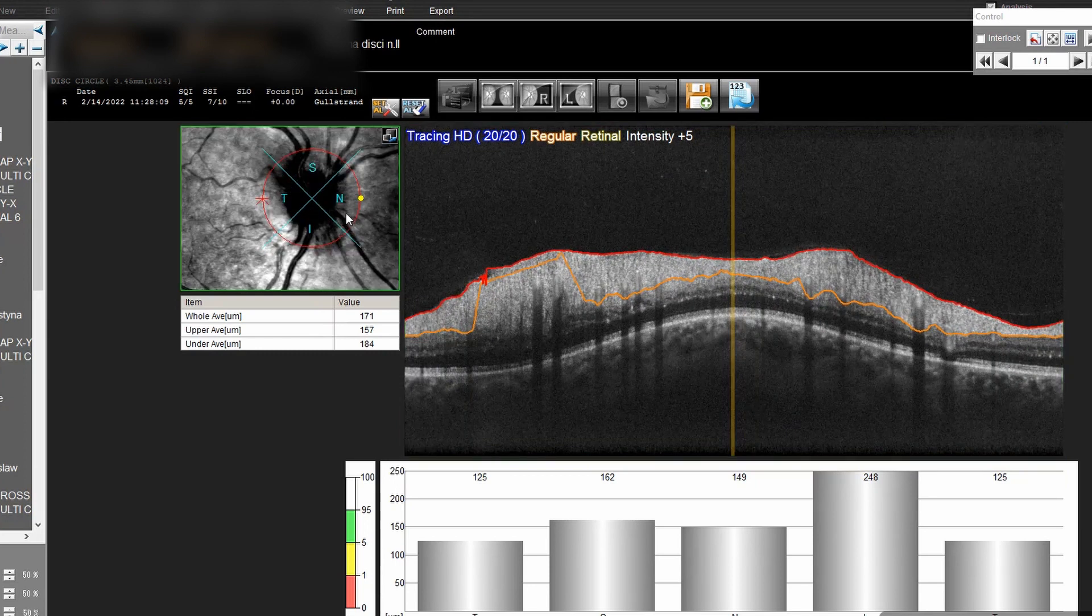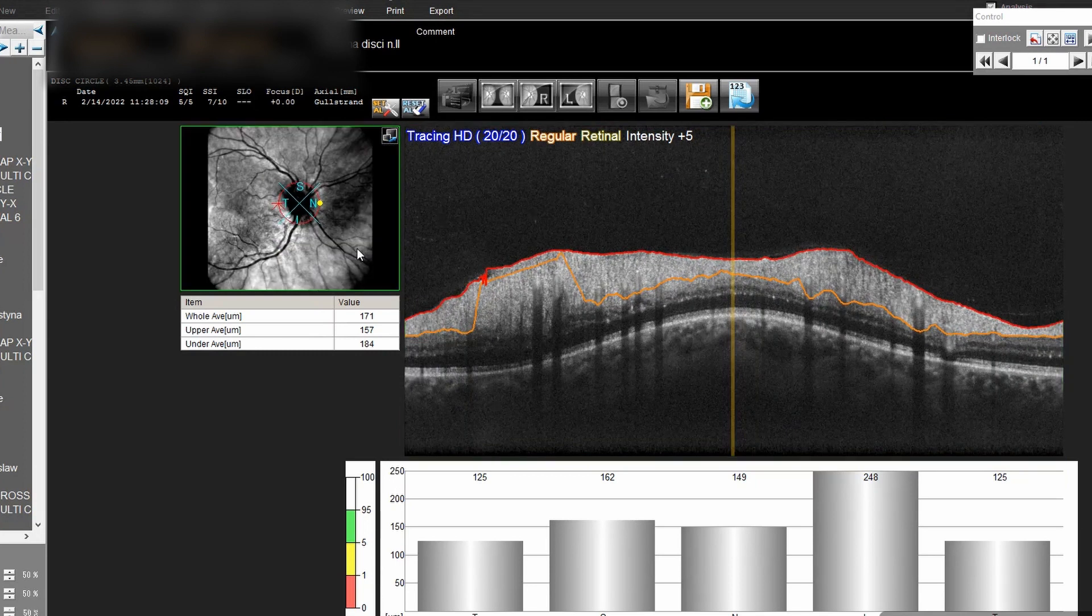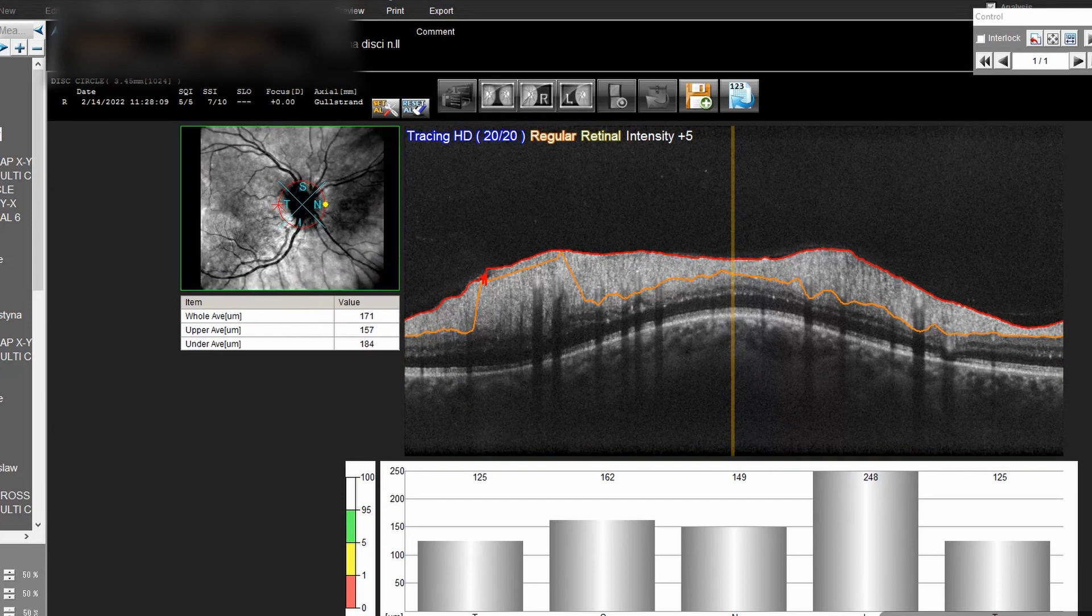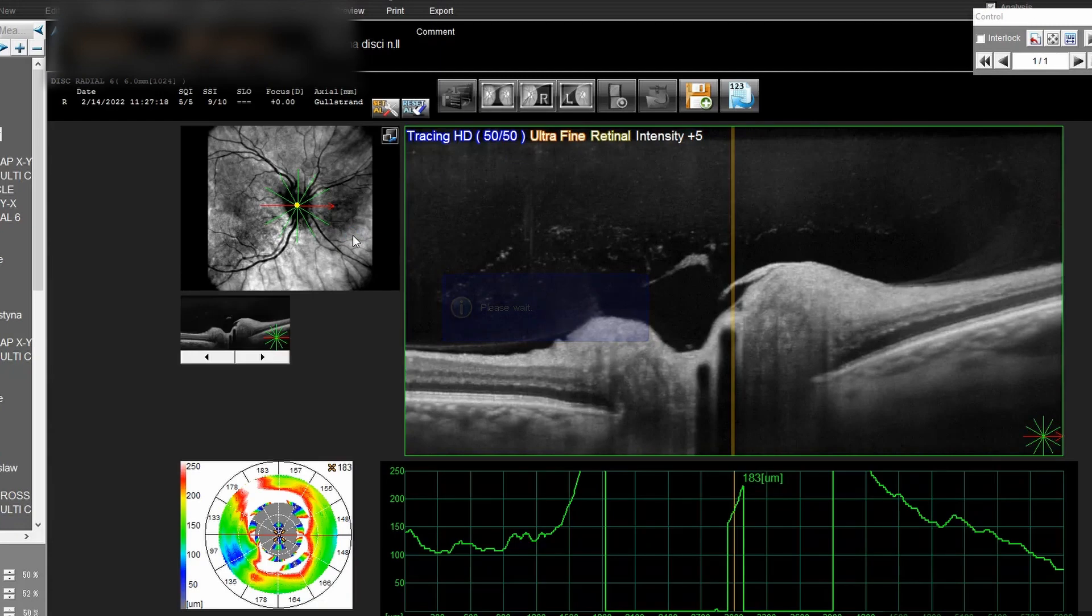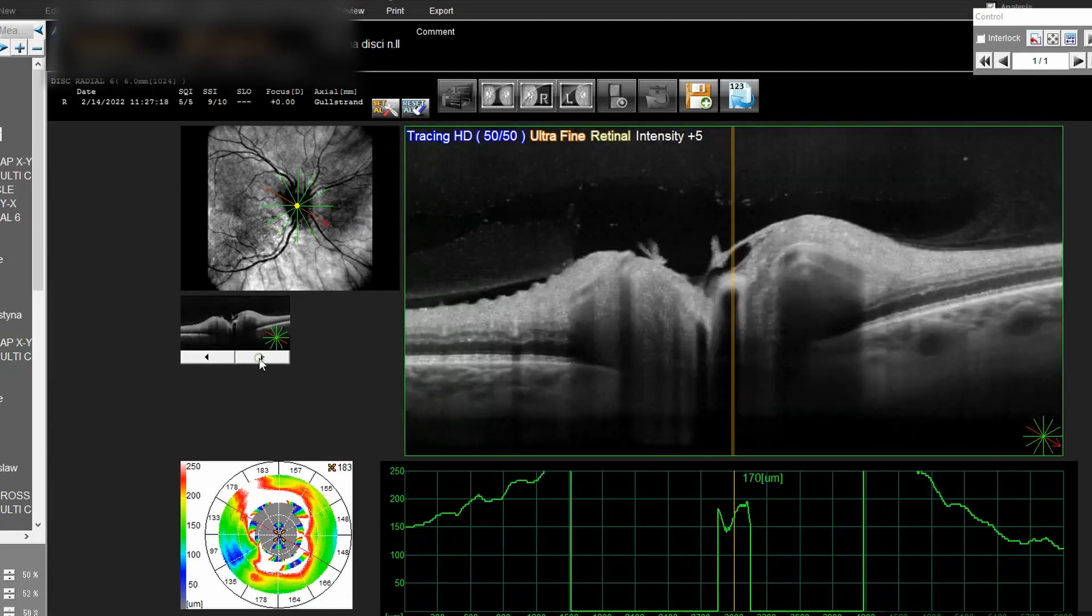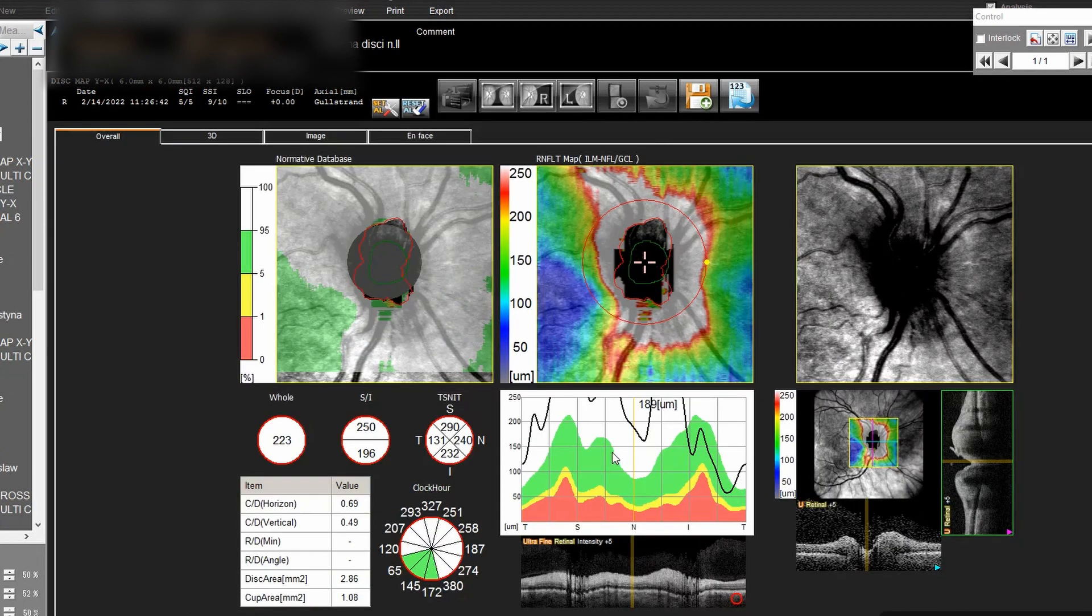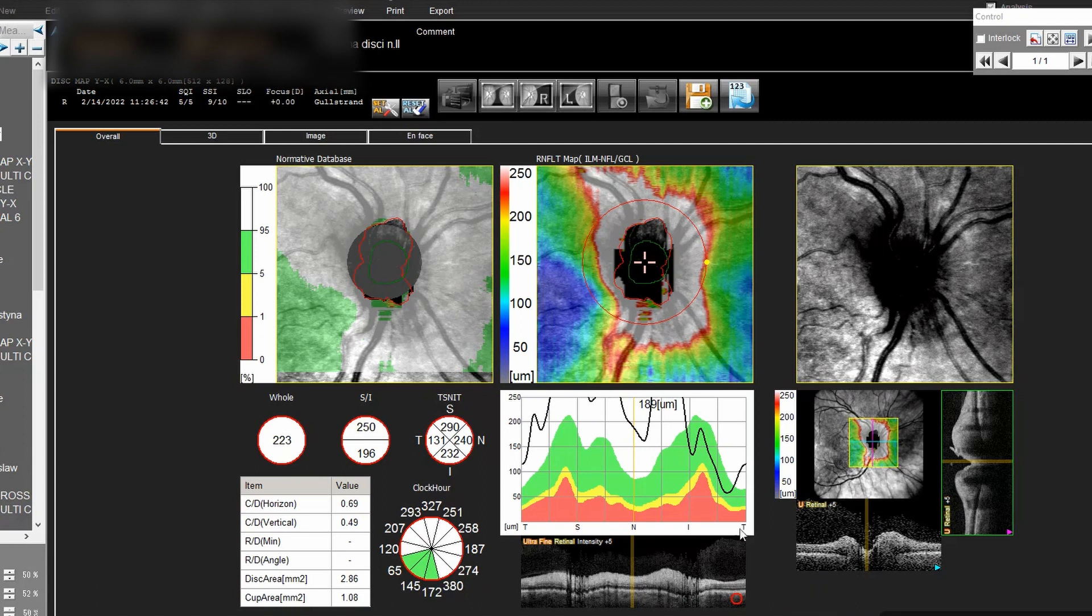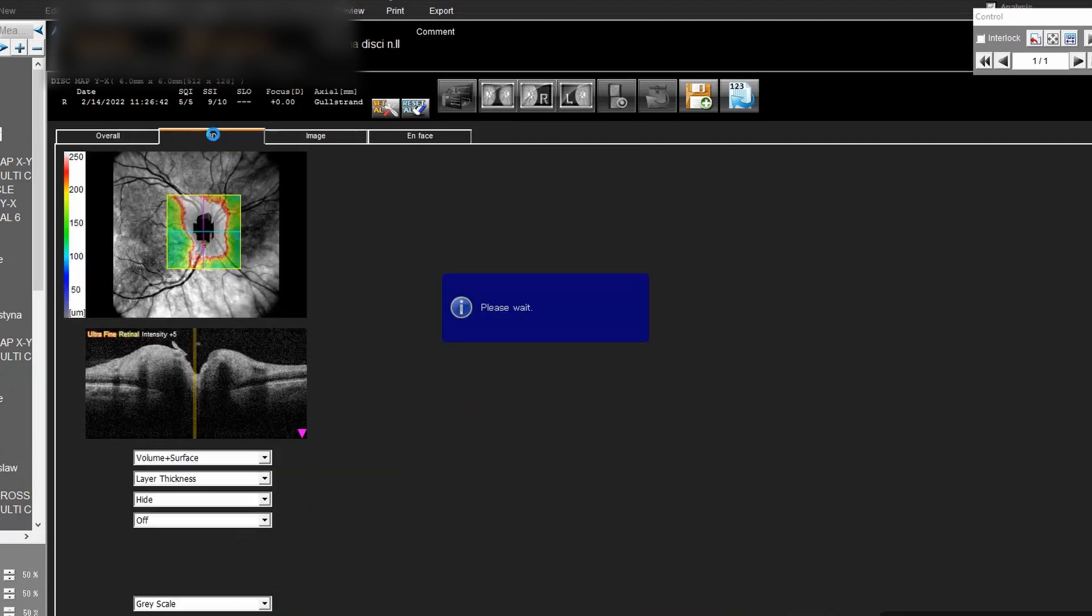This is the disc circle and those graphs pronounce the thickness depending on the sector, so it's an interesting way of displaying. Then you have the raster scans of the optic nerve head and here again you have the graph. Then we have the RNFL thickness maps with different parameters and also quite modifiable.